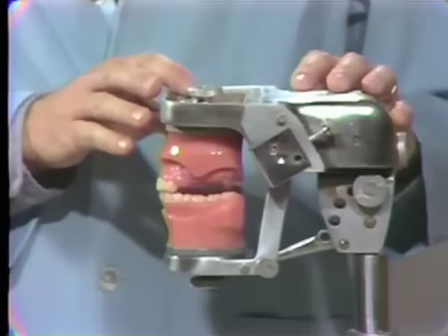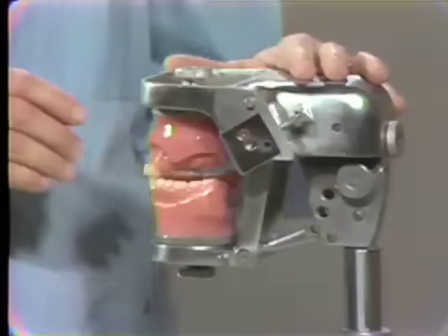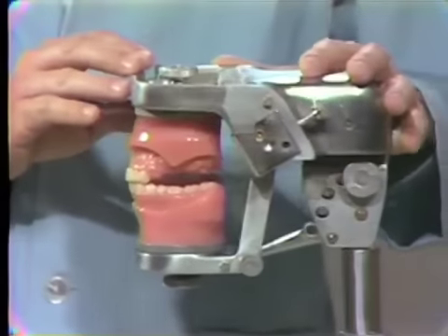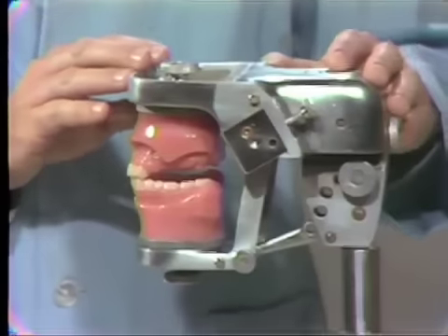To do this, we have simplified the procedure. We didn't want to make an entire exercise out of the face ball transfer and so forth, so we have simplified it. But I think it would make it easier if I explained briefly a couple of items about the mannequin itself.